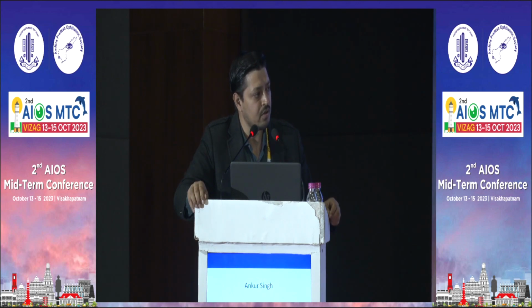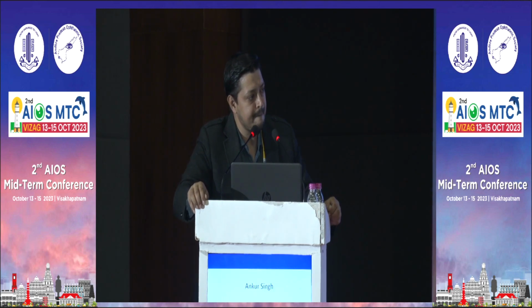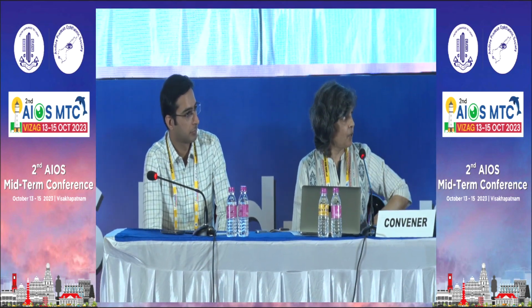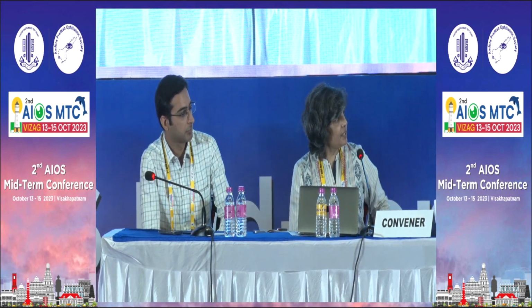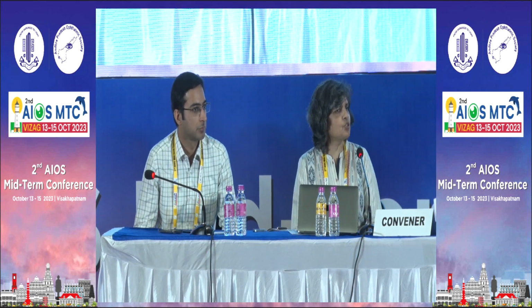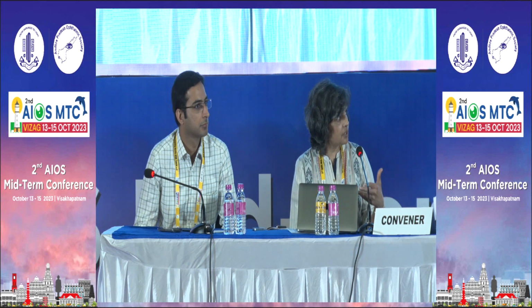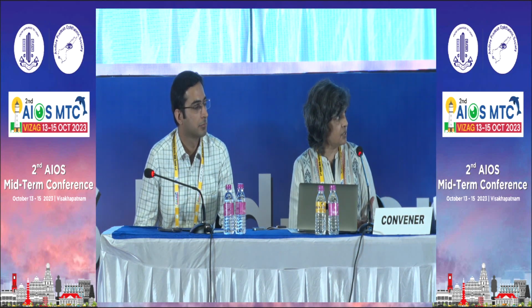Malika, do you do Octa in all CNVMs? No. Initially we used to, but we found that it has no correlation with activity or treatment. So not at every visit. But I think more importantly, we use it to confirm the presence of NVD or NVE. If we suspect there is a fine NVD and are not sure, then Octa can really show up the new vessels on the disc to add the laser.